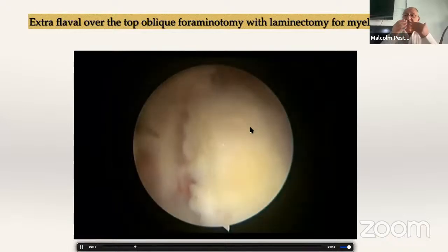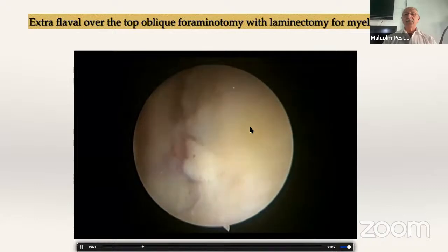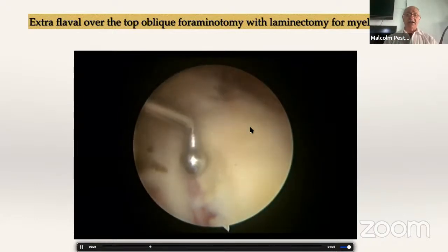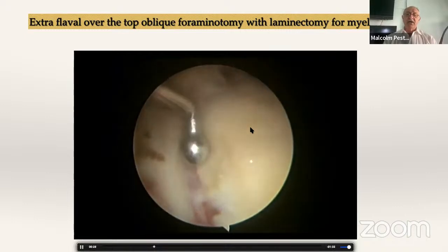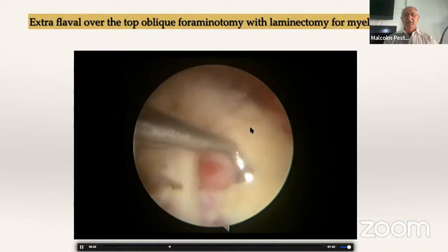And this is keeping the ligamentum flavum intact. Now I'm doing an en bloc flavectomy to remove the flavum, and then I will again go back to that foramen to do the finishing touches. So even in the cervical spine, UBE is a viable alternative. I mean, it's hype, I agree, but it does a lot.